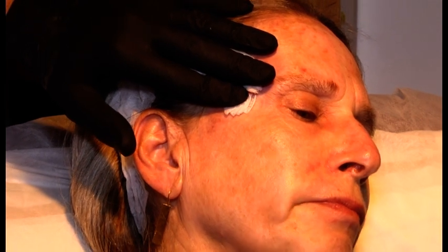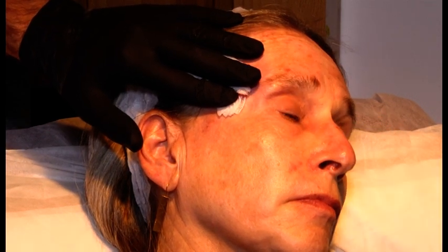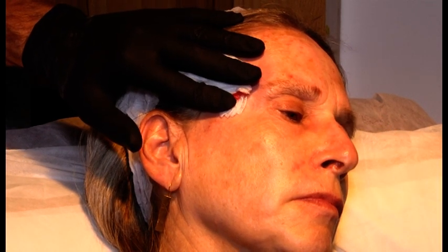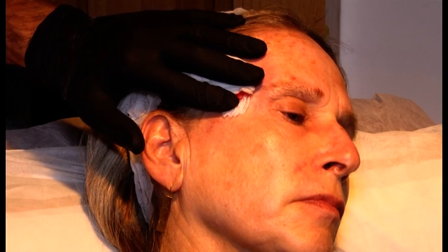And do you have the Radiesse prepared? Fantastic. Thank you very much. This is a 1-to-1 dilution. And can I have a cannula on there? Maybe a blue one. Blue one is good. Thank you very much.